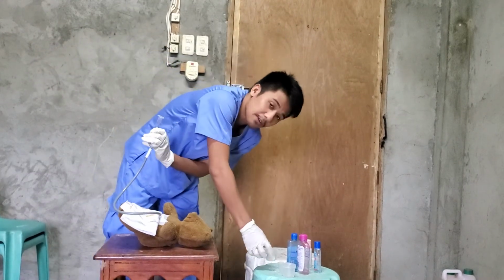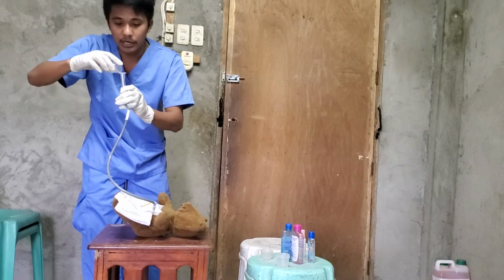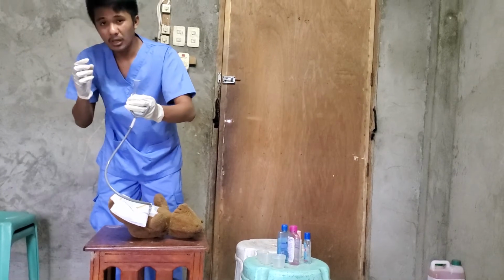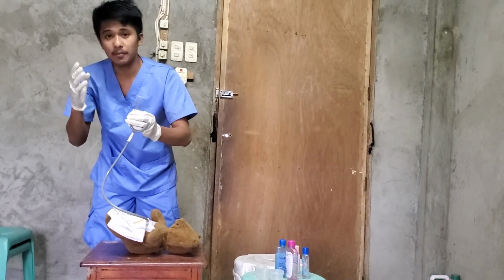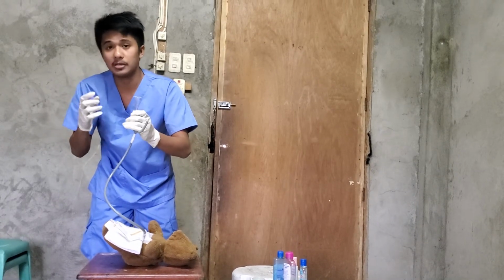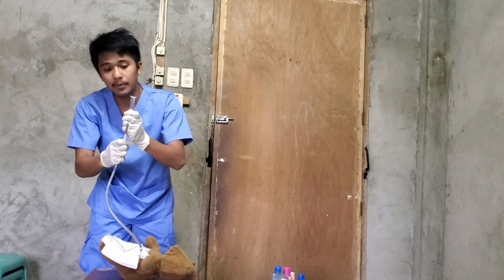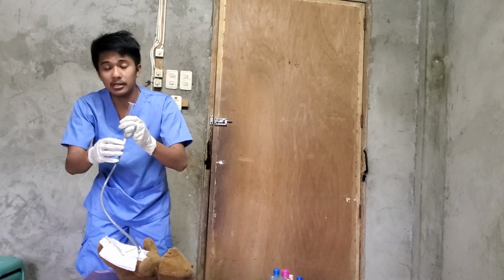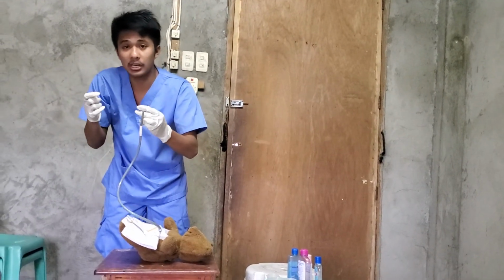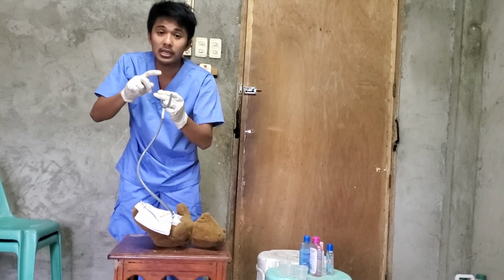Then after that, administer the medication again. After administering, always keep in mind that the next step is to flush. Then after administering medication, you need to close the clamp. Then after that, you need to remove the syringe. Then after removing the syringe, you need to close the end of the tube.